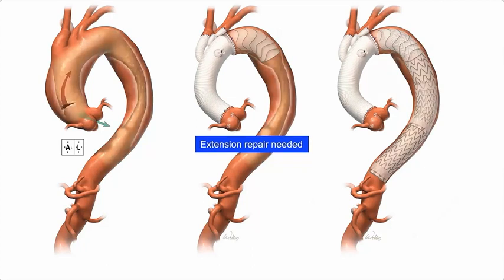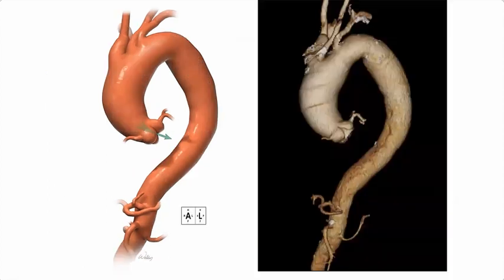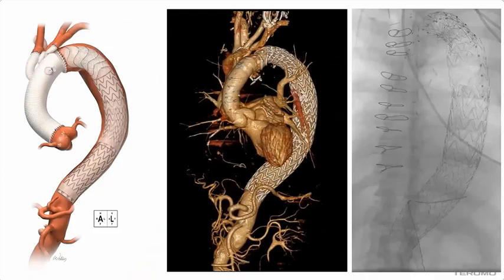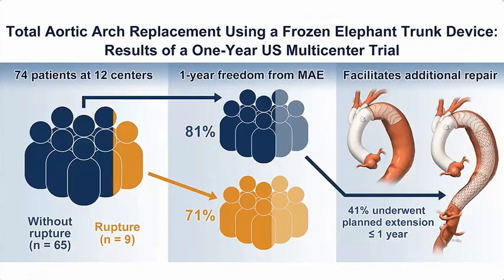Here with 2 devices in fusiform disease, and here in these diagrams in aortic dissection. This is an actual patient from our clinical trial. We used the Plexus device and a 10 centimeter endovascular portion, and we brought this patient back in short order and extended the device with 2 additional endovascular stents down to just above the celiac axis to get an excellent result.